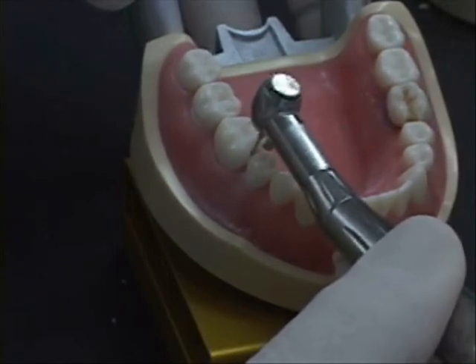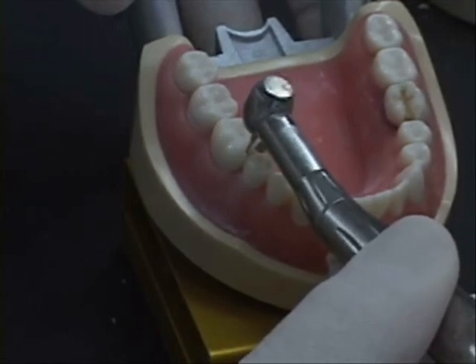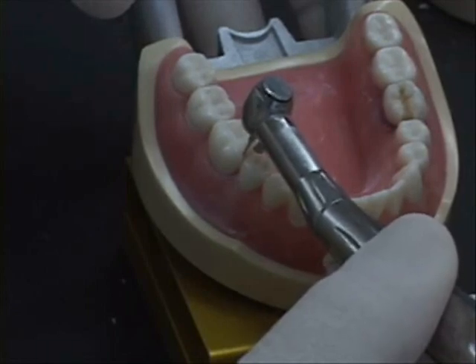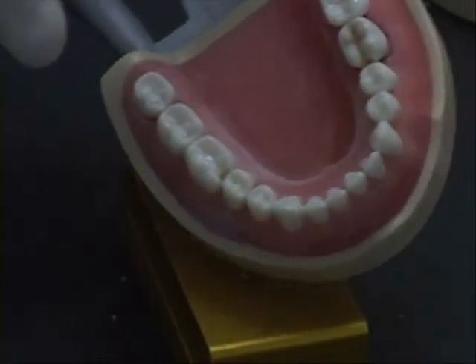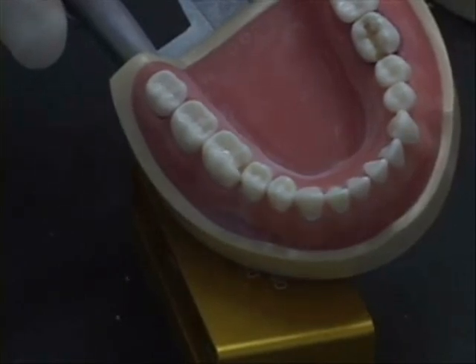And now I'm doing the axial wall, making sure my hand is making the slight curving motion to match the profile of the axial wall. And now I'm doing the facial wall. So I'm stopping short of hitting the other tooth. So there, I finished the preparation. It's all refined and done. Okay, so that's it there.